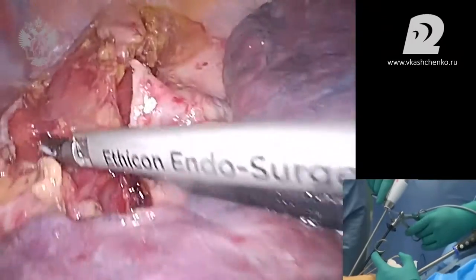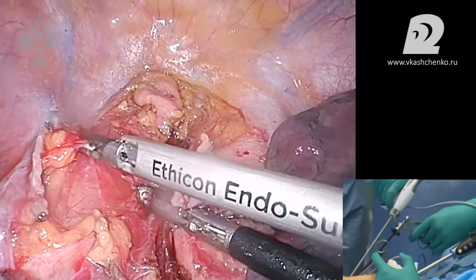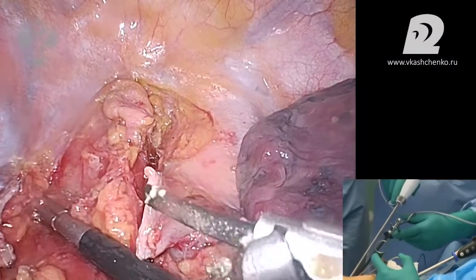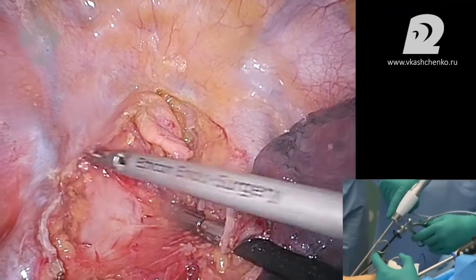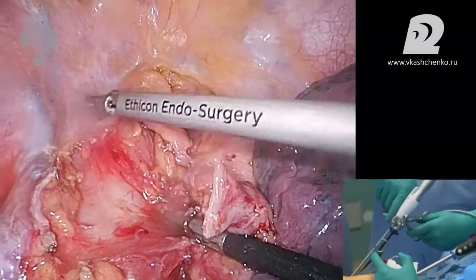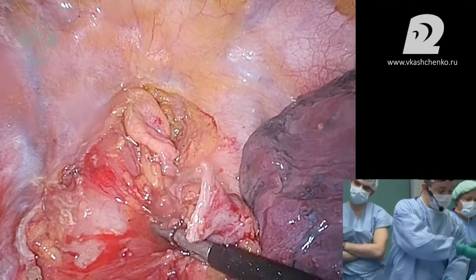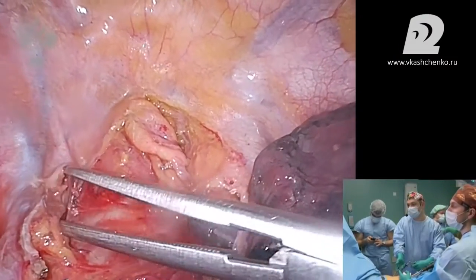Probably what I have seen, I saw you were in the tracheal end when I saw you in the great bronchus. Closer. So no defects, no lesions. Great. Thank you very much. Our endoscopic specialist, Mr. Eugene, has just said that he can't see any lesions, neither in bifurcation area nor in trachea. And it's good news, because it could be a result of my work, or just work of somebody else. Intubation, double lumen intubation gives such consequences.